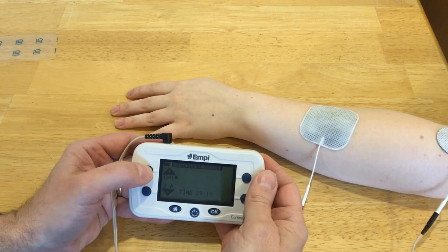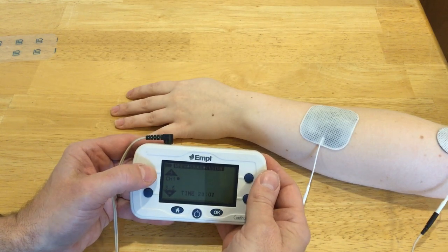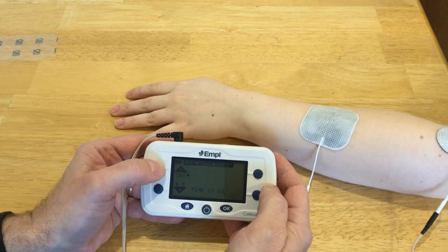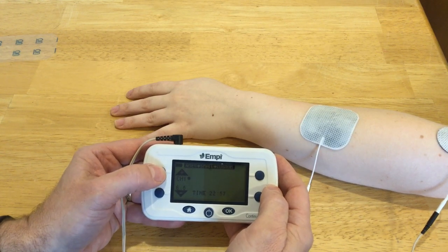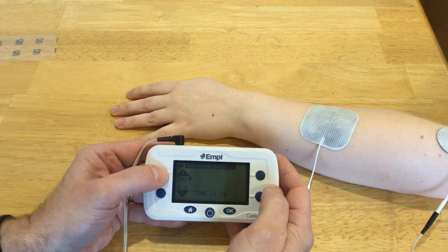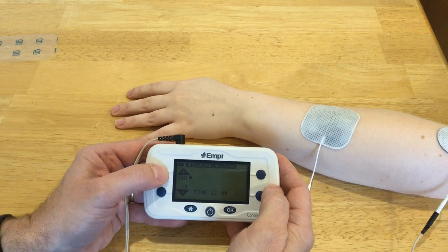Tell me when you feel something. This time my client felt it at 3.5, and we're going to keep going up until we get some motor response. Again, probably mid-teens — may have to go a little higher with that smaller electrode.